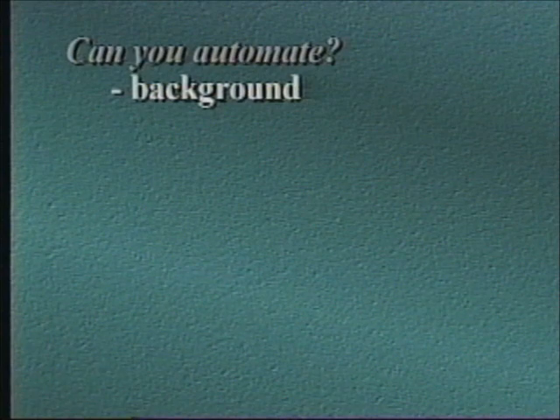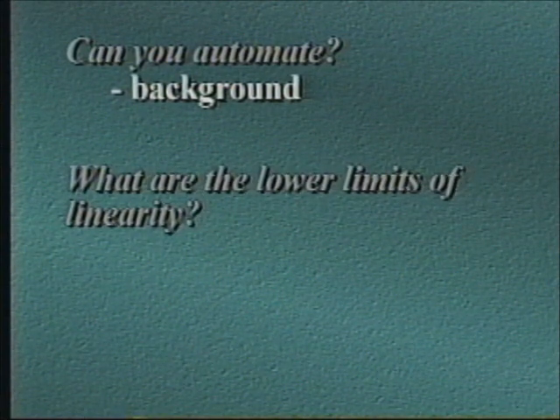Once you have gathered all the information and looked at all the documentation, you need to decide what you can automate. Depending on your background and how the WBC is reported, that may limit the lower linearity or lower reporting range. But even if you can only automate samples with total nucleated cell counts above 1,000, it will be helpful.